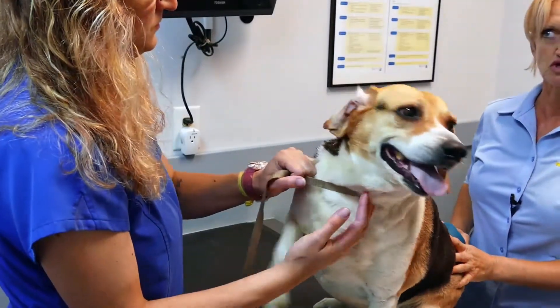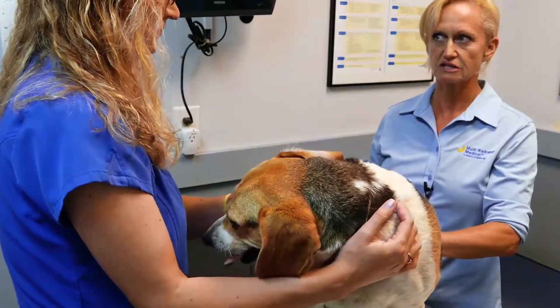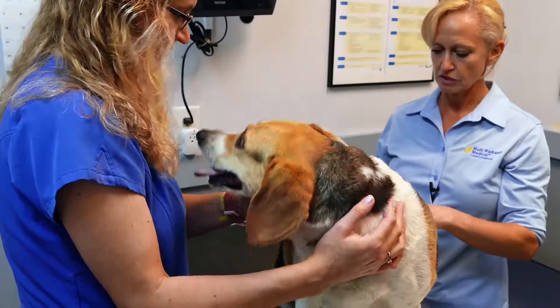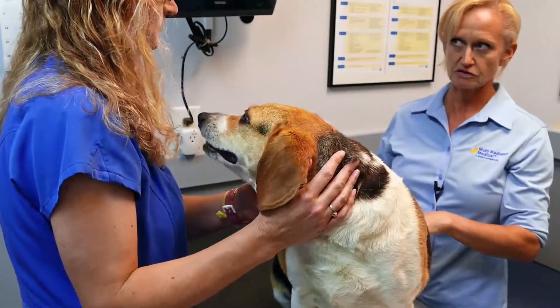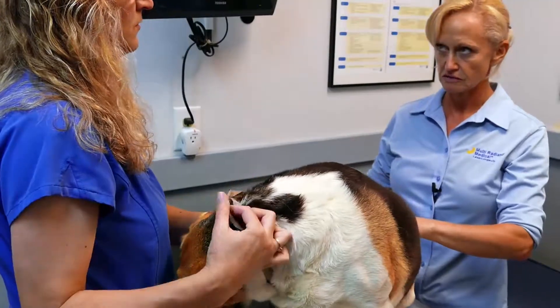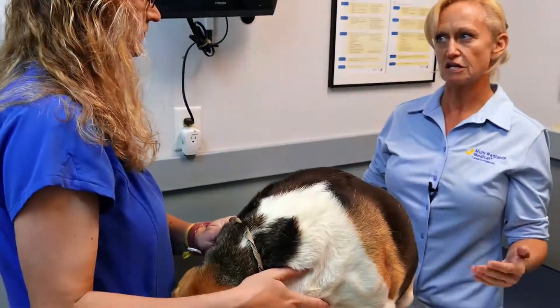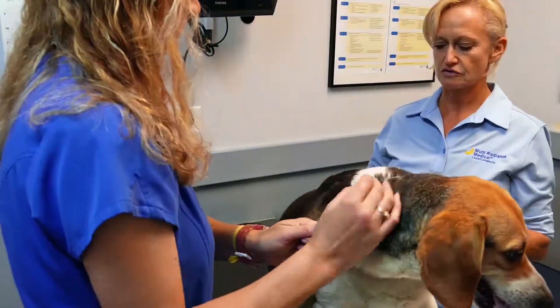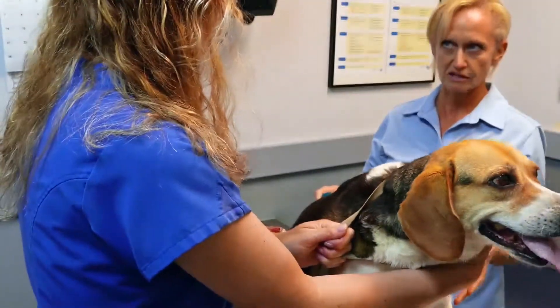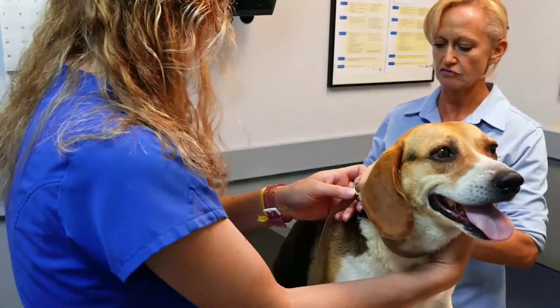Anything healing, the treatment times are always short and sweet. I never really stay in the same area for more than 20 or 30 seconds, because then the dose will become an inhibitory dose — you've delivered so many light photons, it's not stimulatory anymore, it's a bigger dose. Usually if I'm using the blue light, I'll just mirror what I did with the laser. So if I do two minutes with the laser, I'll do two minutes with the blue — that way it's easy to remember and keep track of what you've done.